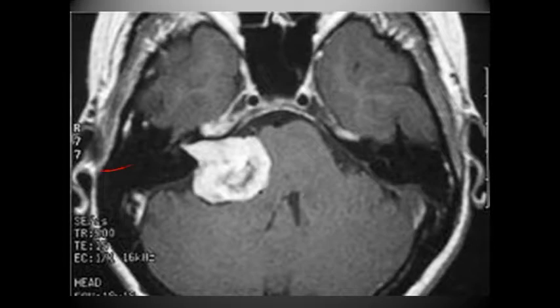Notice that we have the EAM kind of coming in this area here, and we're at the base of the skull, and we have this large area here. This is an acoustic neuroma.